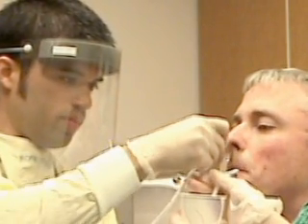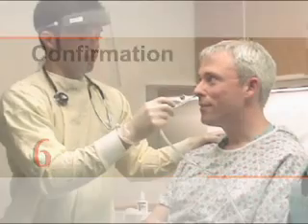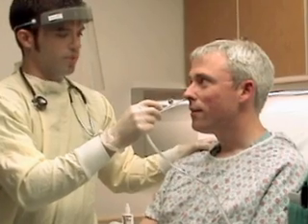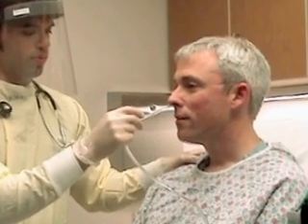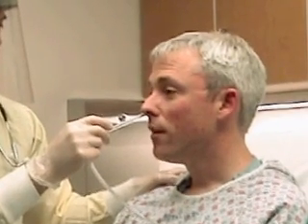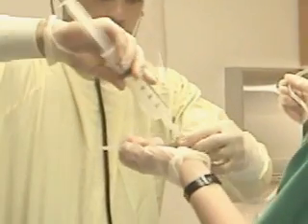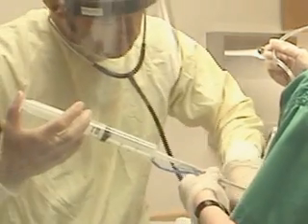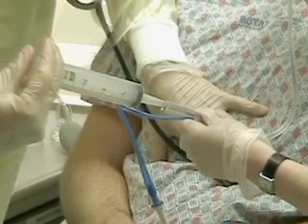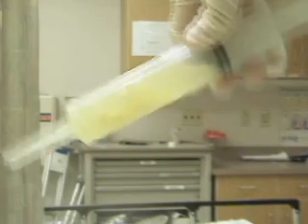Check the black markings on the tube to confirm proper depth of insertion. Assure that the patient is in no respiratory distress and is able to speak. If the patient is unable to talk, is in respiratory distress, or if respirations can be heard through the tube, it should be removed immediately, as tracheal intubation has likely occurred. Attach the catheter tip syringe to the main port of the NG tube and insufflate 30 cc's of air while auscultating over the epigastrium. A gurgling noise should be clearly audible. Using the same syringe, aspirate the NG tube and ensure that it fills with gastric contents.